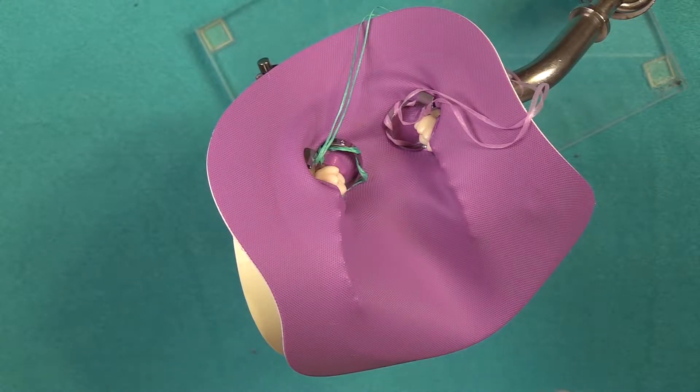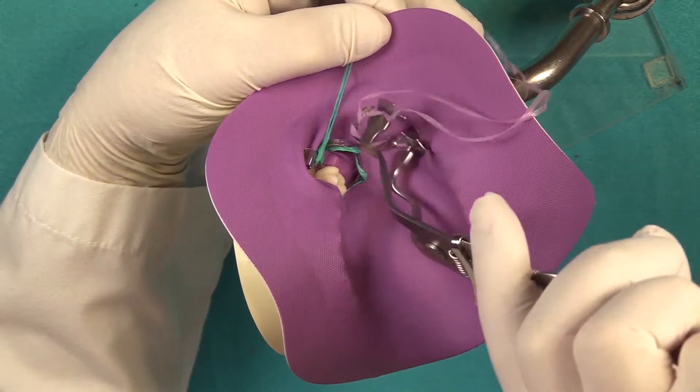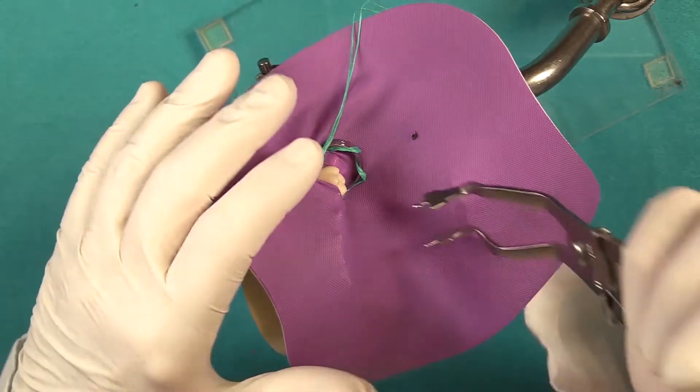When you're removing this, you always want to go in reverse — so we're going to remove the lower clamp first and then the upper clamp.